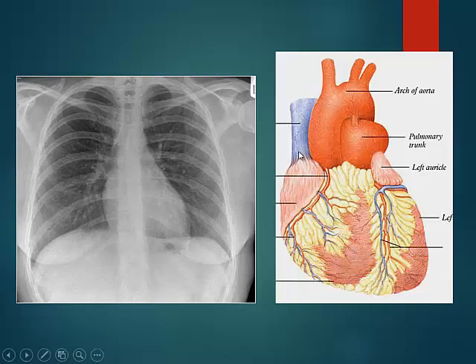So in a normal patient with normal pressures in the right heart, the SVC is barely visible. But if you have a patient with right heart failure, this can become distended and may become prominent. What other structure is here? Ascending aorta. So you can just see here the ascending aorta. If there is aneurysmal dilatation of the ascending aorta, you can have a prominent bulge in that region.